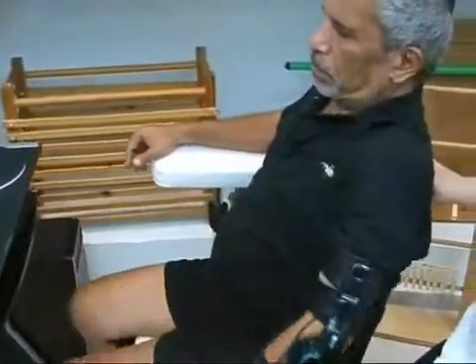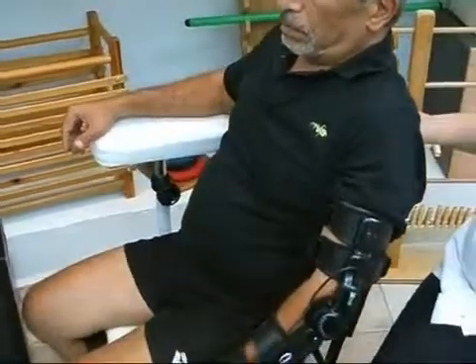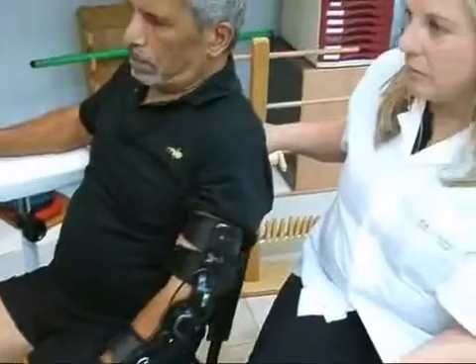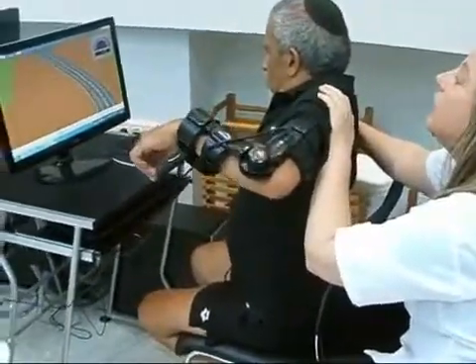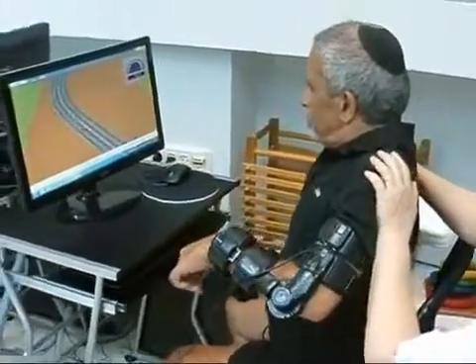The games are customized to the patient's motor, sensory, and cognitive movement ability, including range of motion, speed, and accuracy of movement. The exercises can be undertaken in different positions including sitting, standing, or lying, with the patient performing assisted, active, or against-resistance exercise practice.